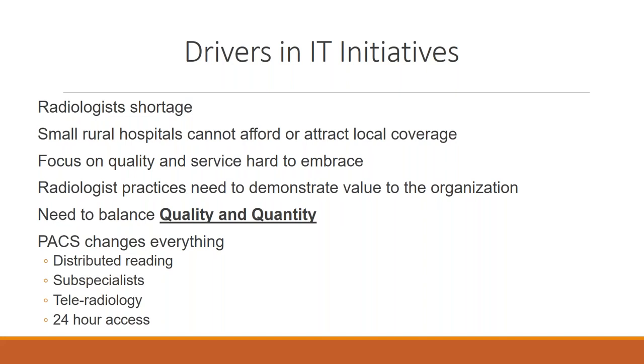And then, of course, as we said, PACS changed everything: the distributed reading, subspecialists, teleradiology, and 24-hour access. PACS was not a big favorite by the referring physicians.